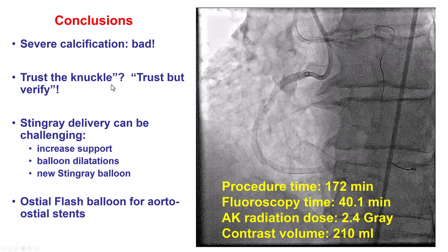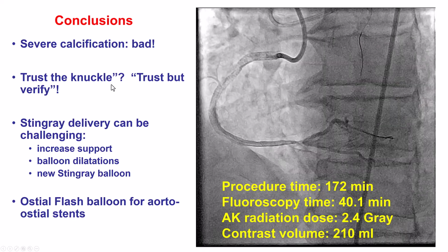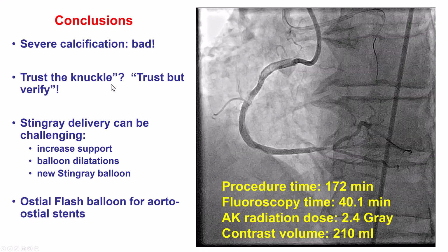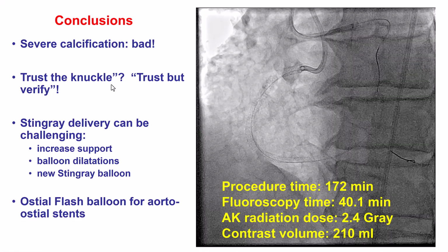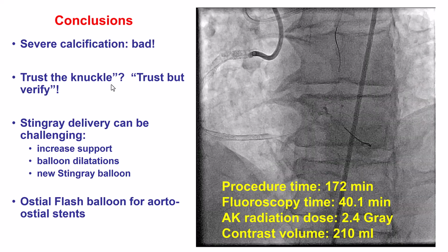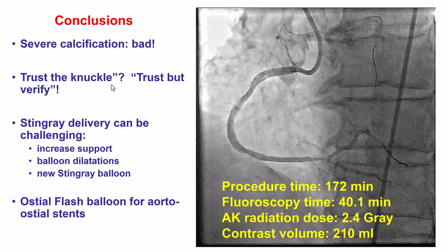Overall, CTO PCI can take some time. In this case, the most prolonged step was delivering the Stingray to the re-entry zone. That took several minutes and several maneuvers, but having a systematic approach and being patient was key to achieving a final success.